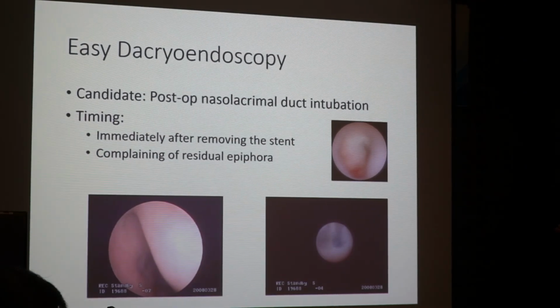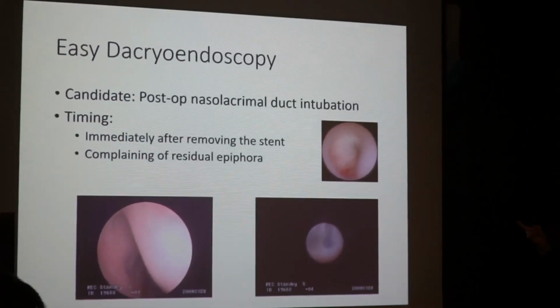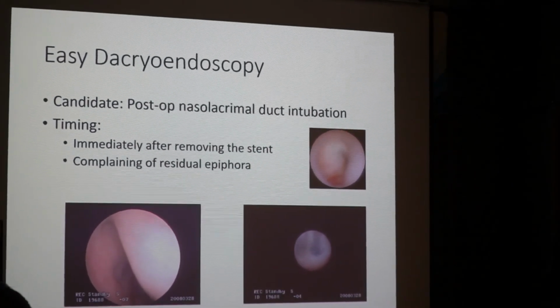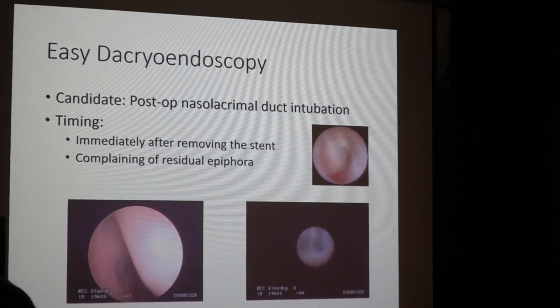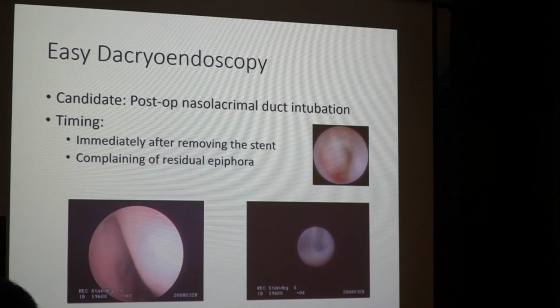Long-term intubation has an increased risk of granulation tissue. So my opinion is long-term, more than 3 months, no. I remove the lacrimal stent every time at 2 months.